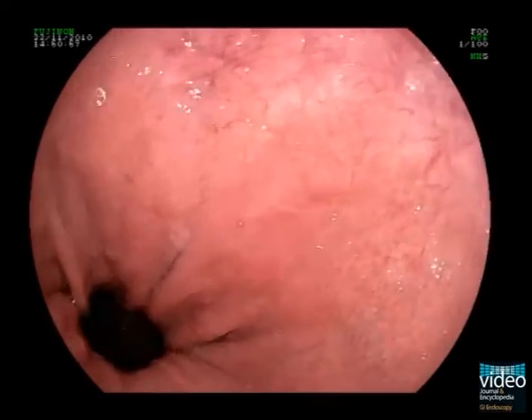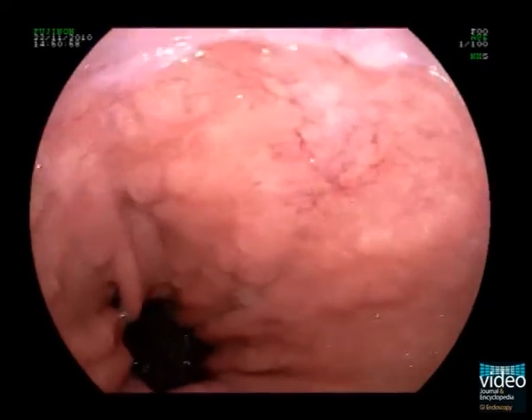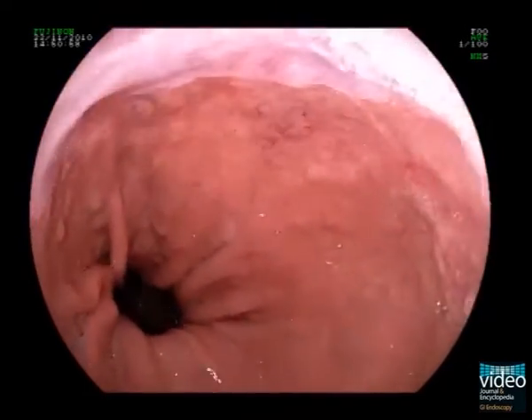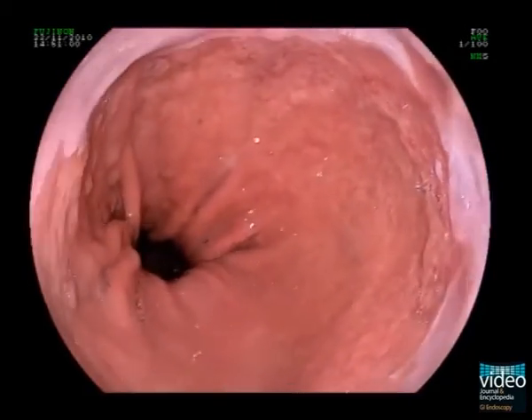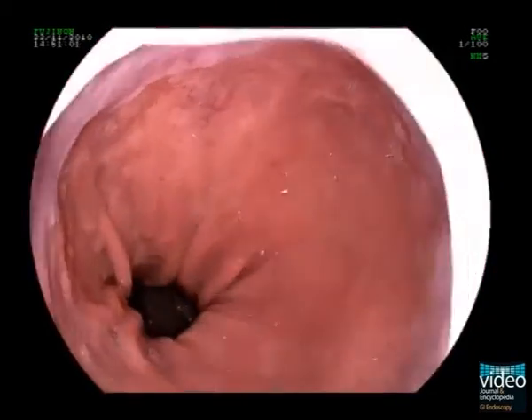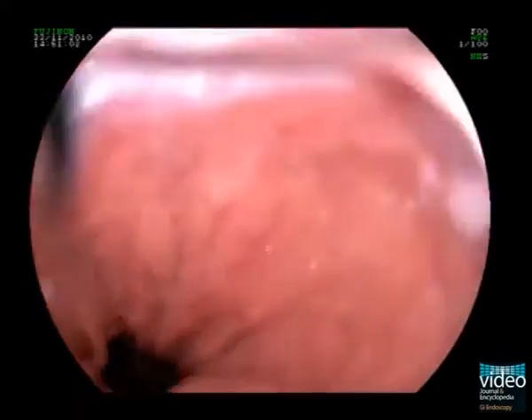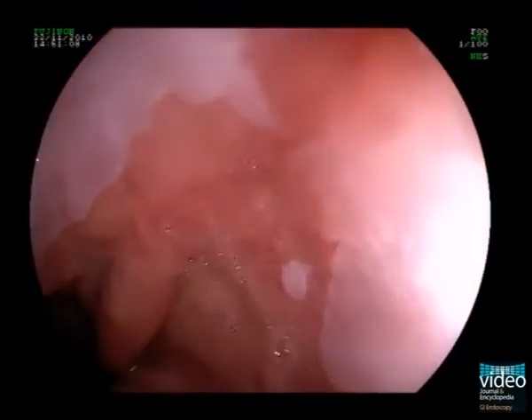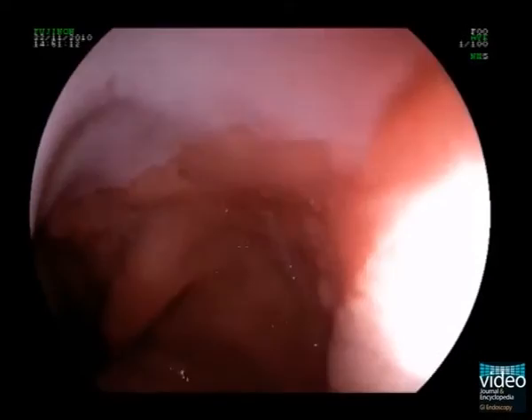This is a 65-year-old Caucasian male patient referred for endoscopic diagnosis and treatment of Barrett's high-grade intraepithelial neoplasia. A short tongue of columnar-lined epithelium is seen at the 2 o'clock position. The tongue is hardly visualized in the antegrade position.